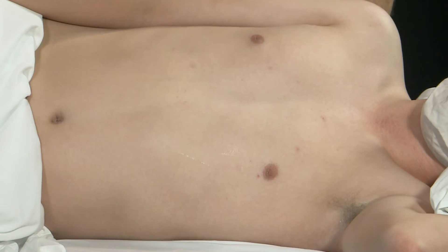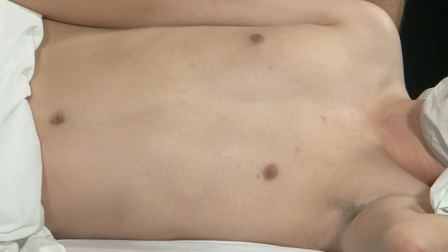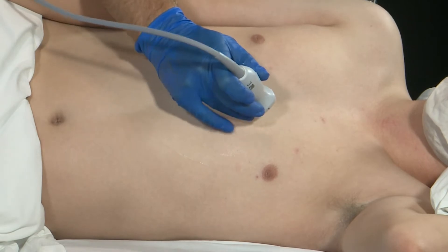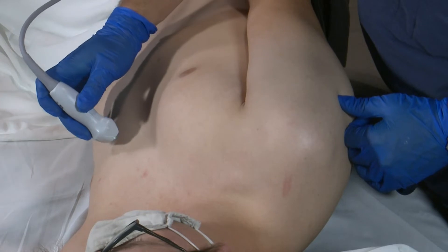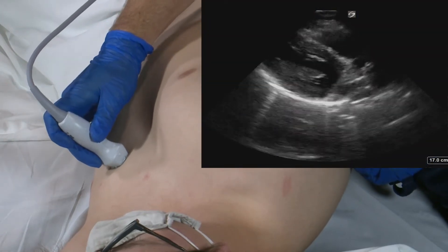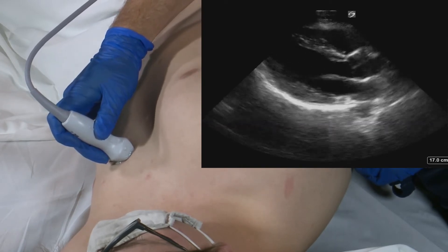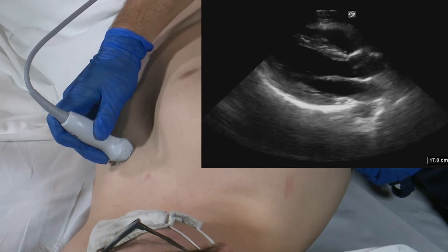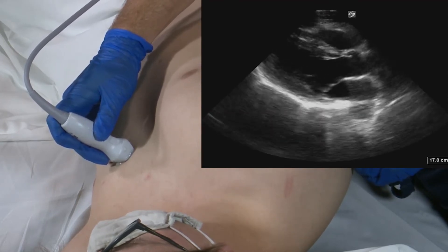For the traditional four-view cardiac exam, we're going to start off with our parasternal long axis view. We're going to place the transducer immediately lateral towards the sternum, somewhere between the second and fifth intercostal space, with the marker dot pointed towards the patient's right shoulder. Here, we're going to move the transducer around so that we have our best image of the right ventricle, the aortic root, the left atrium, the left ventricle, and the anterior leaflet of the mitral valve.